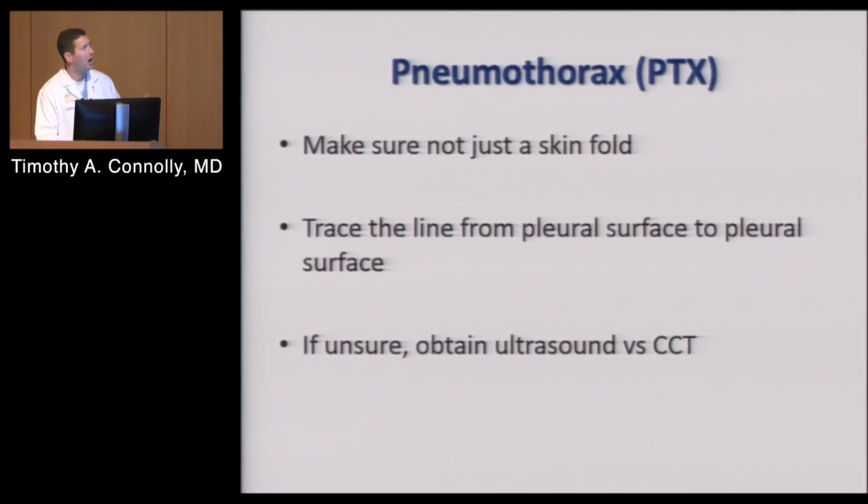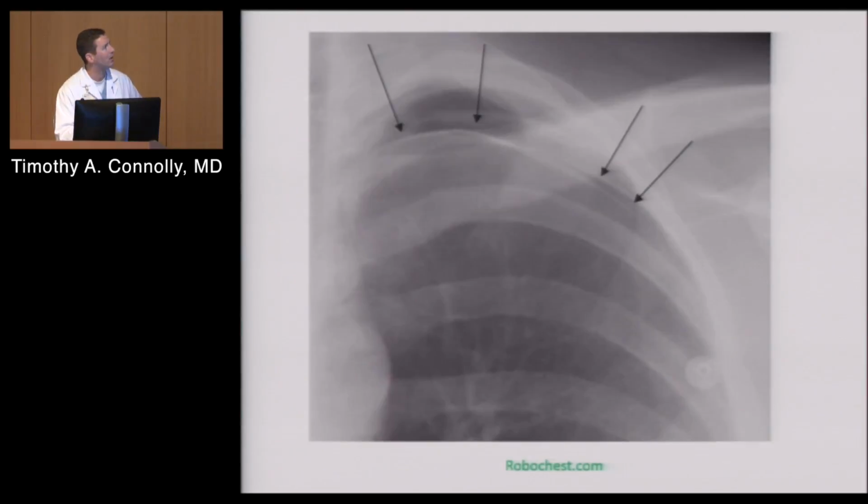And so it's not uncommon for skin to get pushed around and for folds to sometimes be highlighted on imaging. So it's really important for someone who clinically is doing beautifully, no alarms are going off, no blood pressure problems, they've been fine on the same settings forever. If suddenly you're getting an urgent call that they have a pneumothorax, I'd be triple checking before rushing in to do anything.